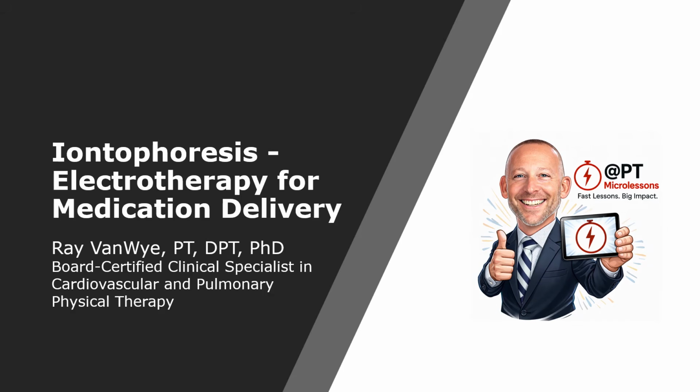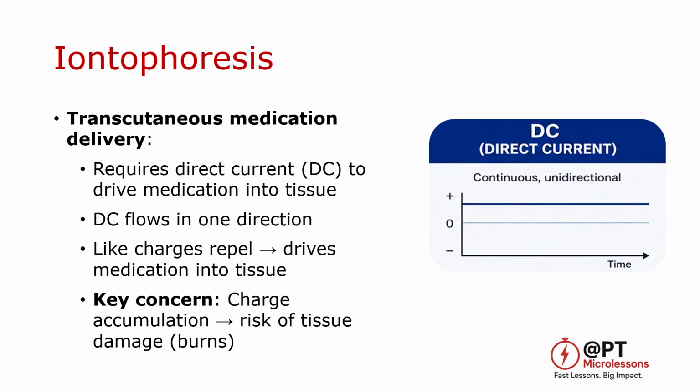In this lesson, we'll focus on iontophoresis, an electrotherapy technique used to deliver medication through the skin. Iontophoresis is a method of delivering medication through the skin using direct current. Direct current is required because it flows continuously in one direction.